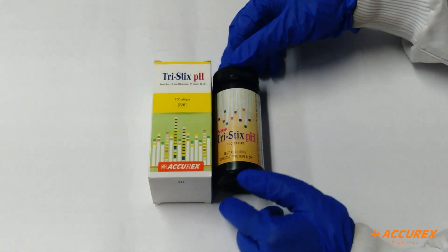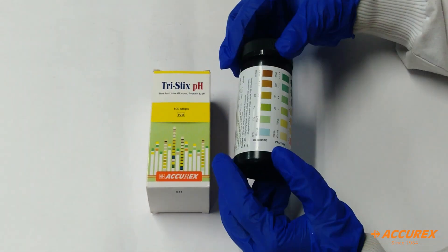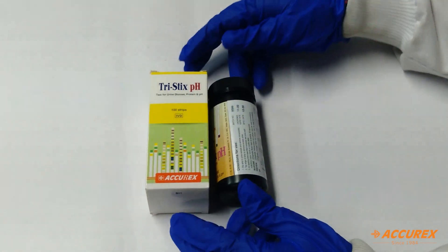In this box we get one bottle with 100 strips and we get a color chart to compare all three parameters. Now we'll proceed to the testing part.